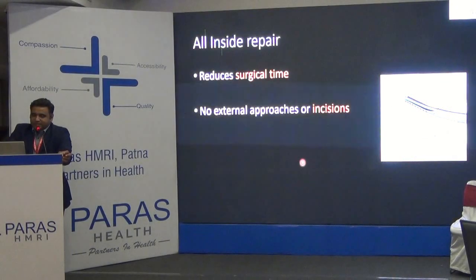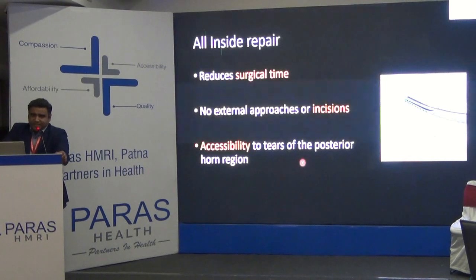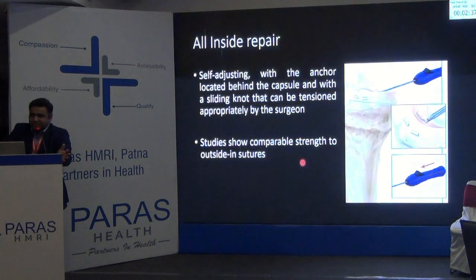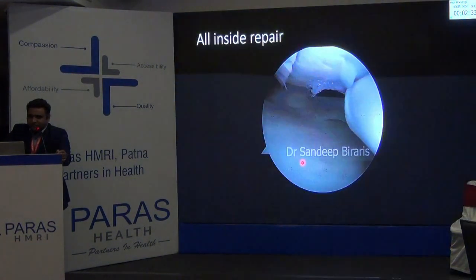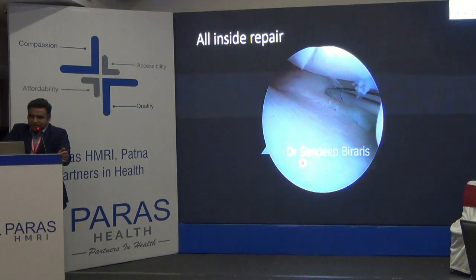All inside reduces surgical time. There is no external incision, and it is very easy to access each and every corner of the posterior horn. There are various commercially available devices for all inside repair, as we have seen in this live surgery. So I'm going to skip this video.